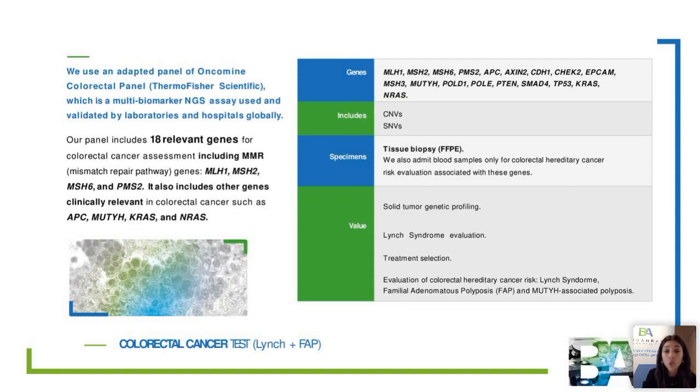And because of the composition of the test, we might start thinking about whether the patient fits the requirements or not to be classified as a Lynch syndrome patient, and also other syndromes such as FAP, related with the APC gene, or the MUTYH-associated polyposis syndrome.